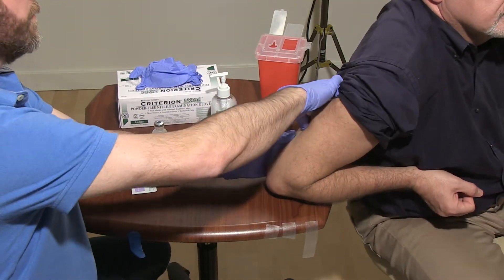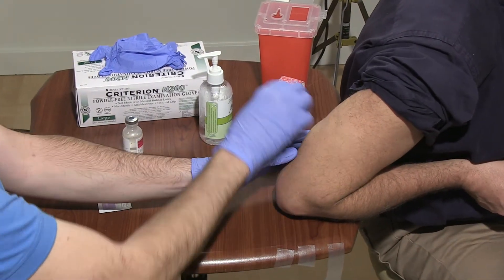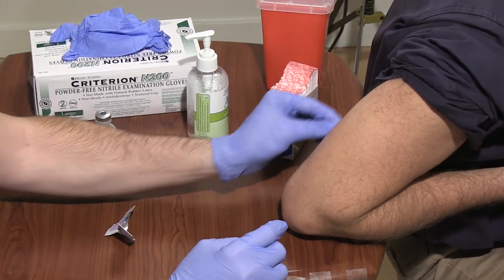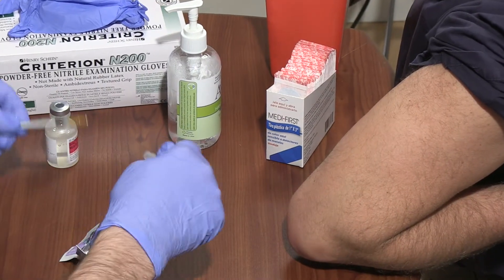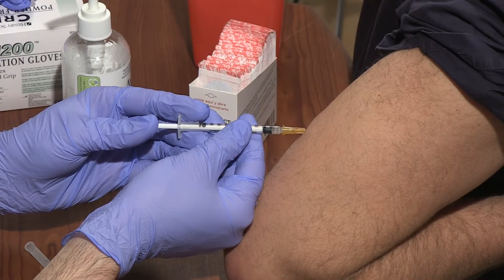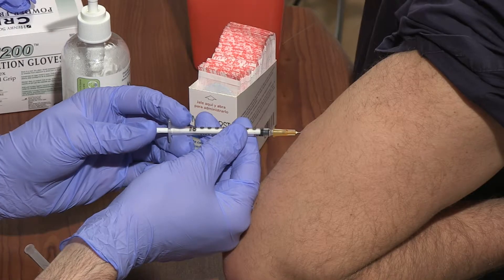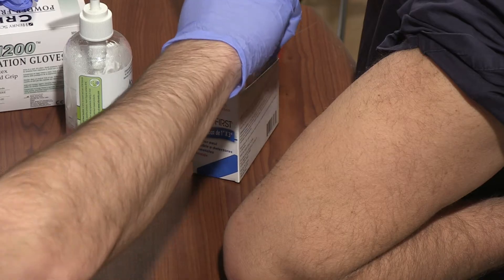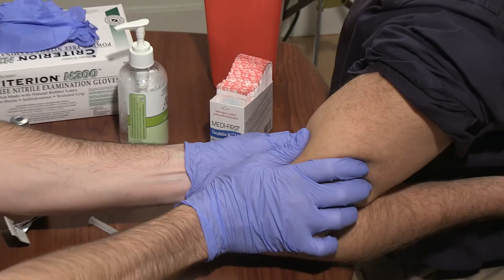Feel for the back of the arm. That's what I'm going to inject. Alcohol wipe, circular motion outwards. 45 degrees, all the way in. Bandage. And they're ready. Good to go.